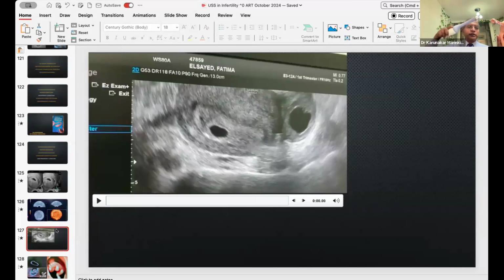And that's just, I only scan it. I have the videos to show, but we don't have time. So the vertical insertion, rotate the probe clockwise, and then go east-west, nothing else. I only rotate the probe clockwise 90 degrees and go to the left iliac fossa, right iliac fossa. That's the whole scanning.